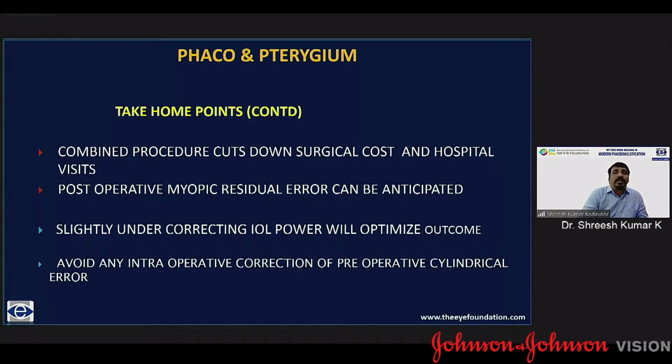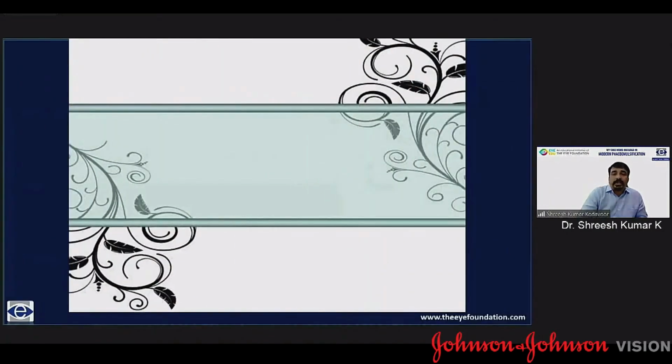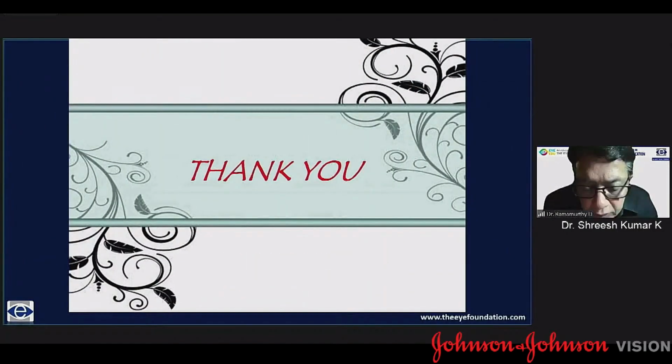Just before proceeding for a combined procedure is to avoid any intraoperative correction of preoperative cylindrical error. This is due to the fact that the exact pre-existing astigmatism cannot be distinguished from the astigmatism induced by the pterygium itself.